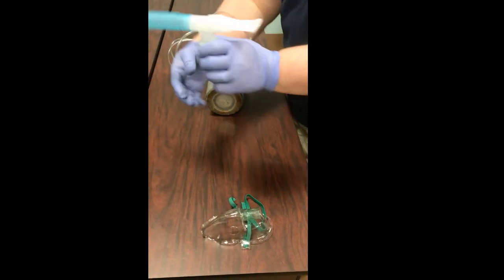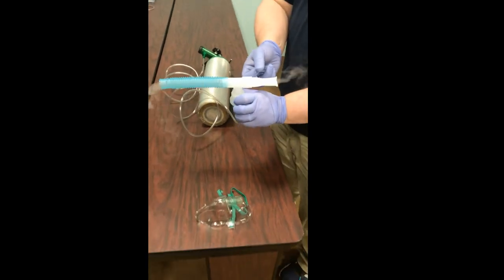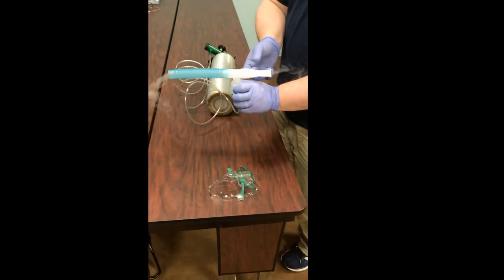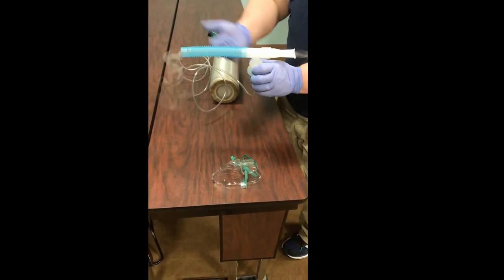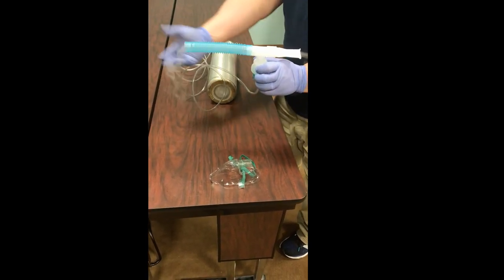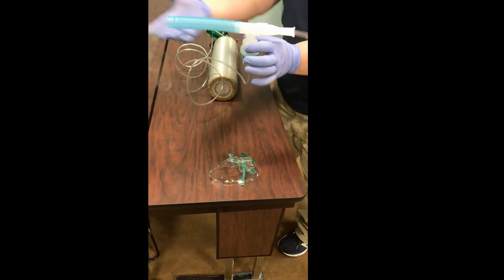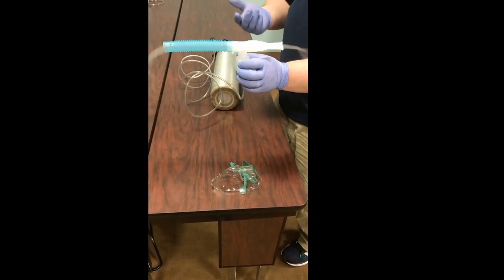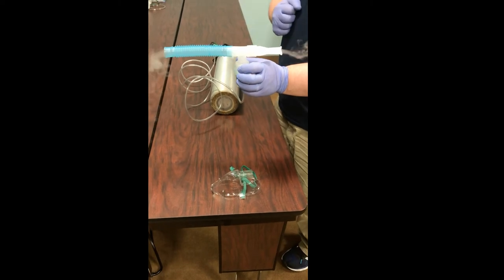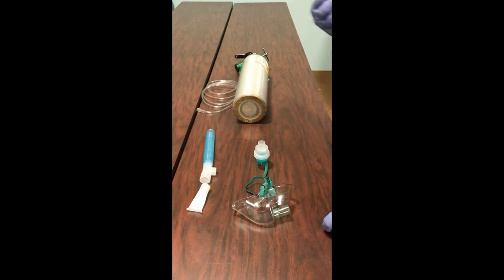With the device on and the tank set up, we attach it to our chamber. The patient puts it to their mouth and breathes it in. We can see it's causing aerosolization — the oxygen goes through the liquid and makes it into a mist that the patient is able to breathe in.